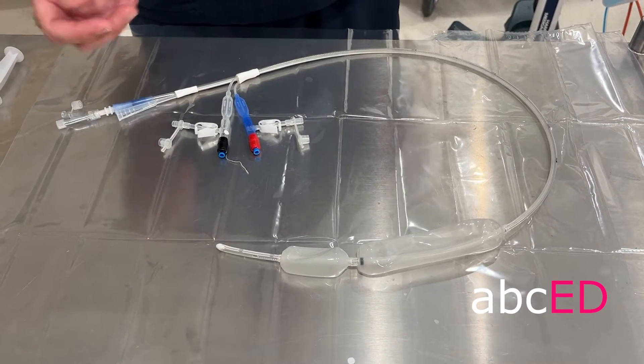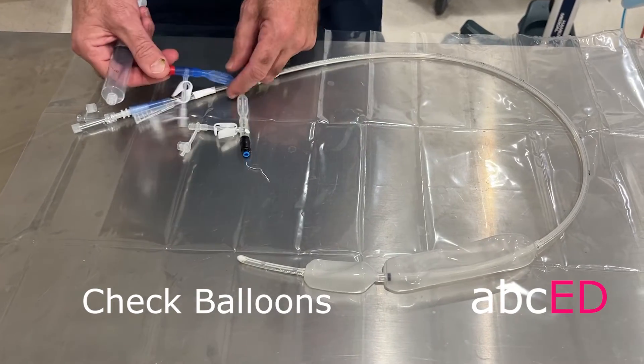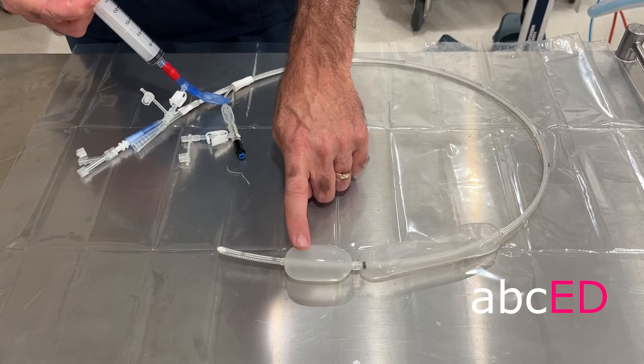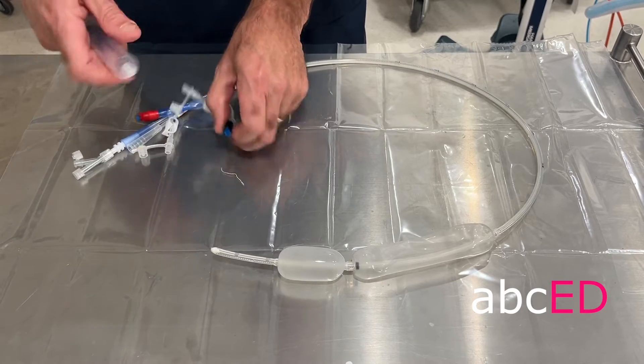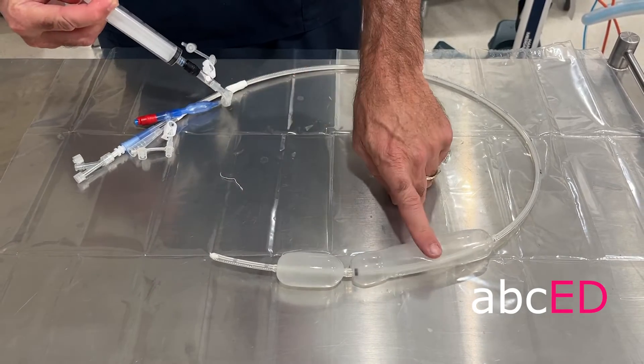Before you put the tube in, just test that your gastric balloon is working. That's the gastric balloon with 20 millilitres in it, and then you can test the esophageal balloon in the same way. That's the esophageal balloon.